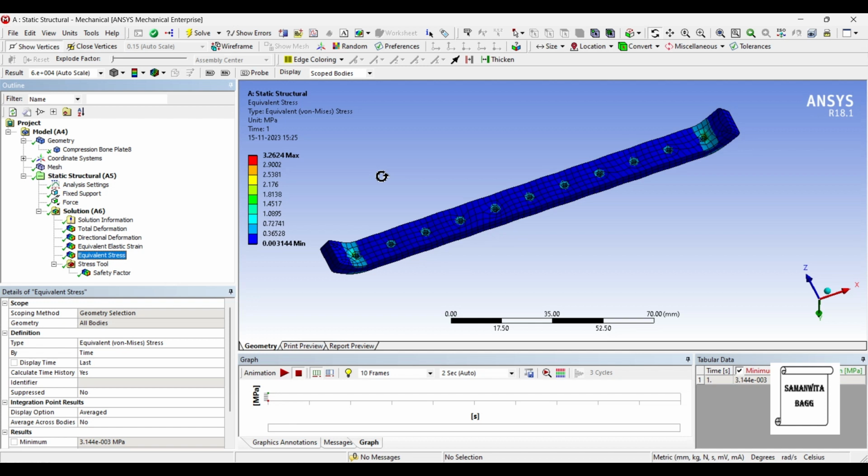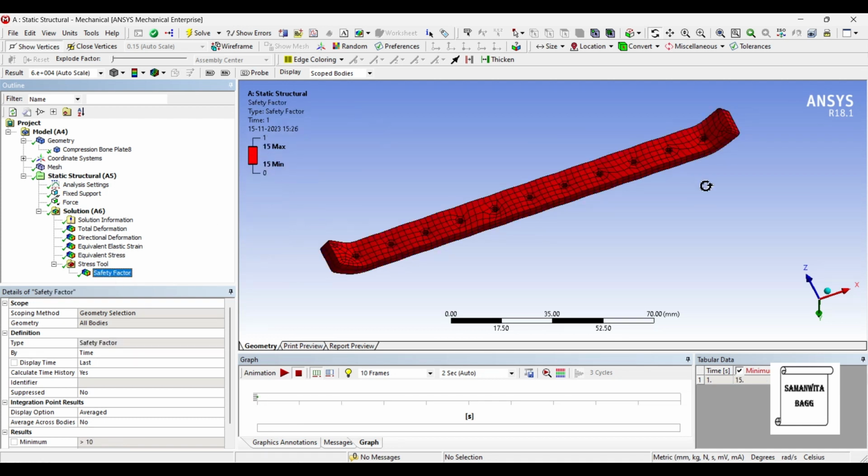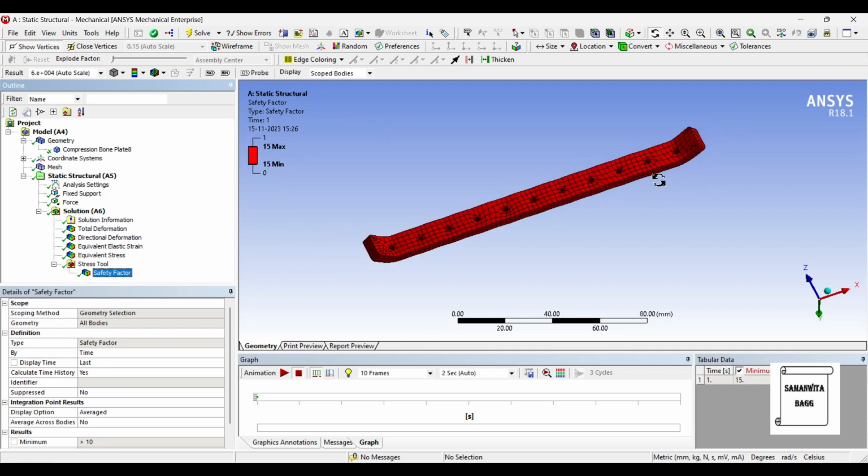You have seen what we have applied. It is 620 or 310 megapascal in compression which we have applied, and we are just getting very small values when we apply a load of 100 newton. You can check the factor of safety, and it's still showing 15. So in this way, you can analyze these compression plate bones with the help of static structure analysis to know what would be the effect of the compressive load on this plate.